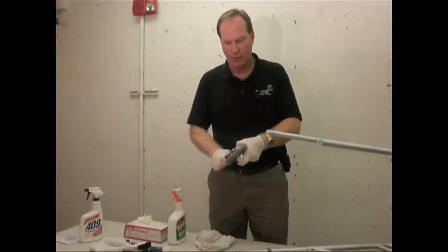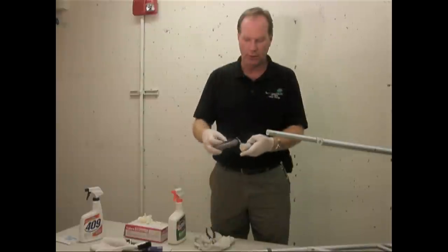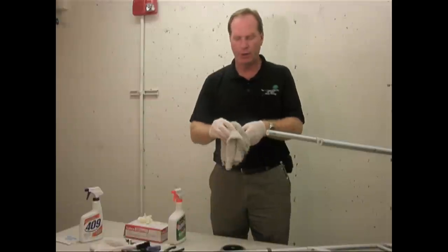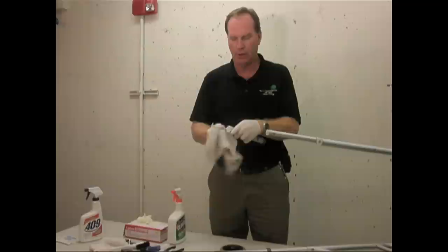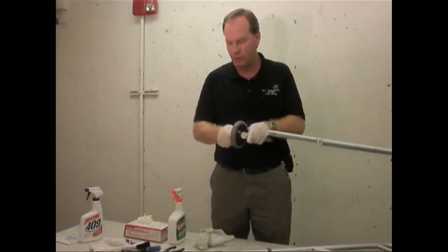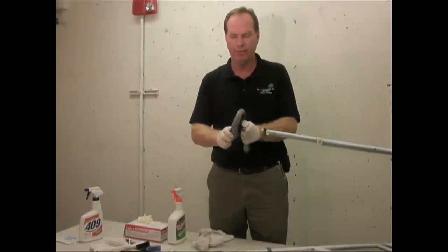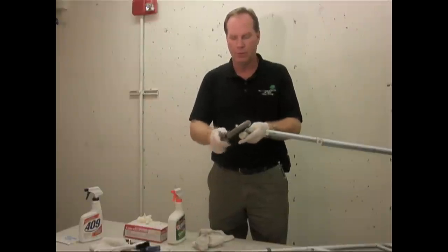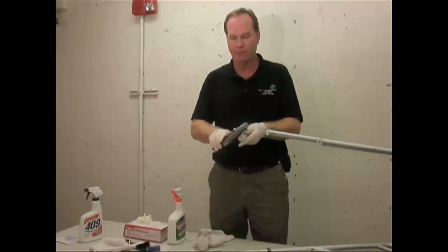Sometimes hair and other foreign particles get stuck in moving parts. Take the wheel off — this doesn't require any lubrication, it just needs to be cleaned. When you put it back together, you'll notice you can tighten it too tight and the wheel won't roll. So you need to tighten it just enough and then back up a little bit so it rolls freely.